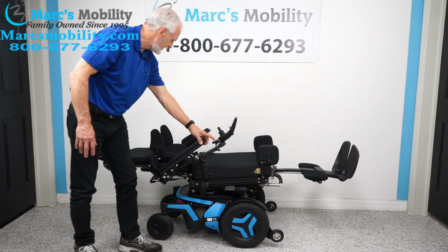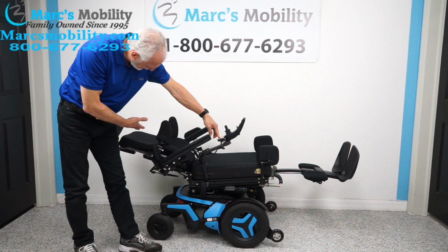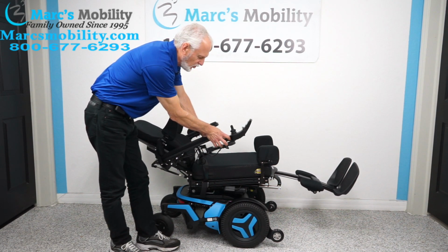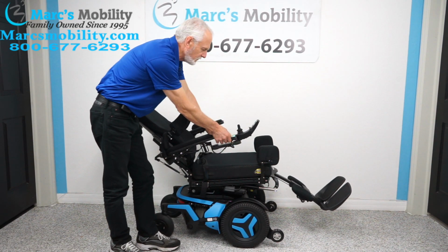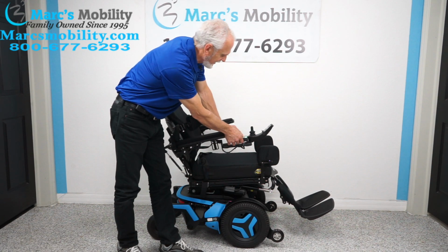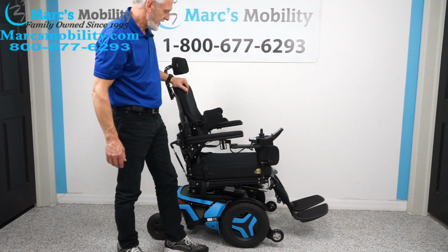So if I bring back the recline just a little bit, if you didn't want to go all the way back, you just wanted to be 80% reclined, you would just leave it right there, okay? So I'm going to bring the recline back up. I'm going to bring the legs back down at the same time. I'm using 2 buttons at once right here with 2 fingers, but you can do that through the joystick over here if you want to. When you're outside, it's always a good idea to leave these legs extended out a little bit so you have more room, but this one seems to have a lot of room under the feet, plenty of room under this one. Okay? So now we got the seat back to driving position.